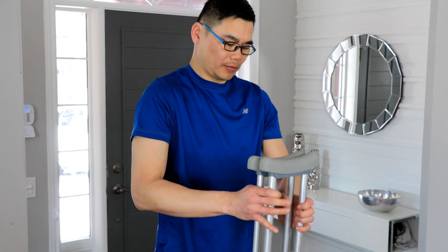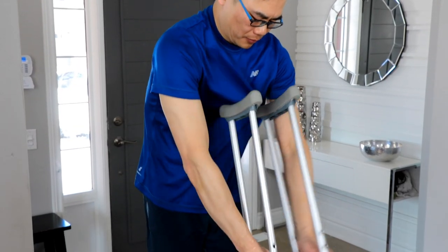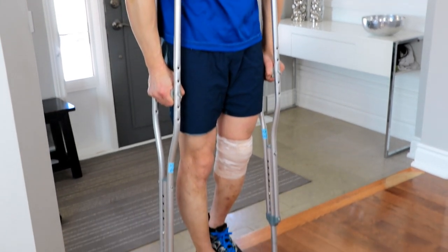When your surgeon says you're ready for partial or toe touch weight bearing, you're ready to put the surgical leg on the ground. The crutches always move with the surgical leg in order to reduce the amount of weight the surgical limb must bear.